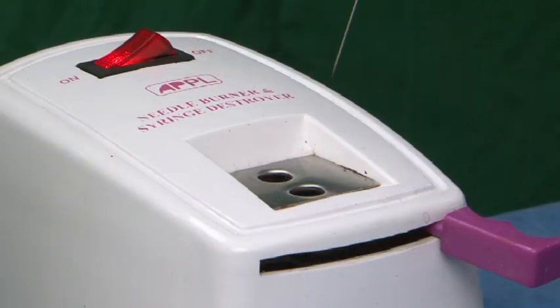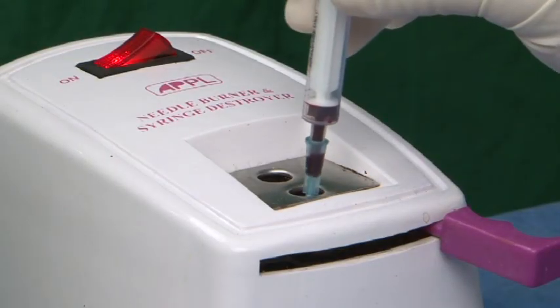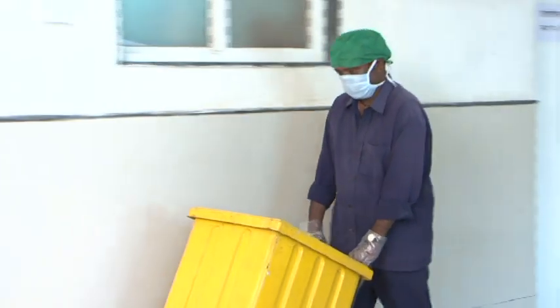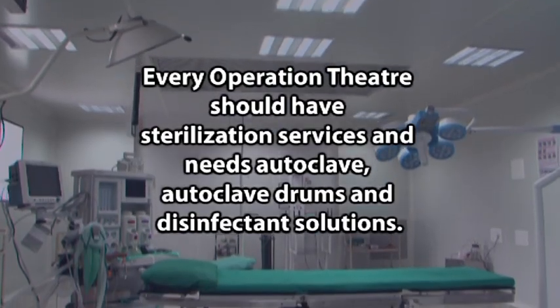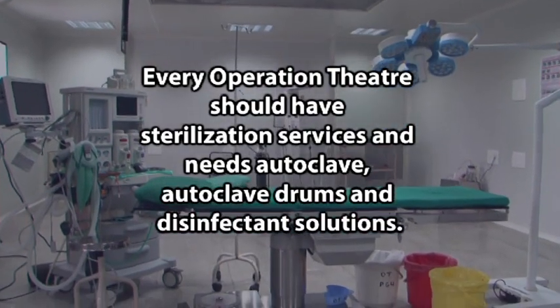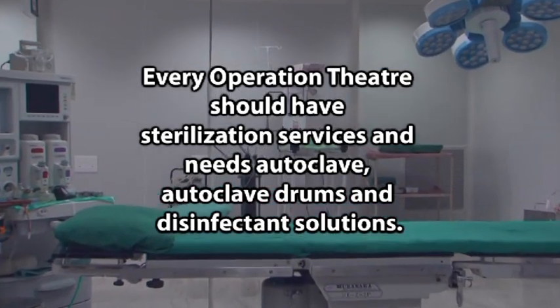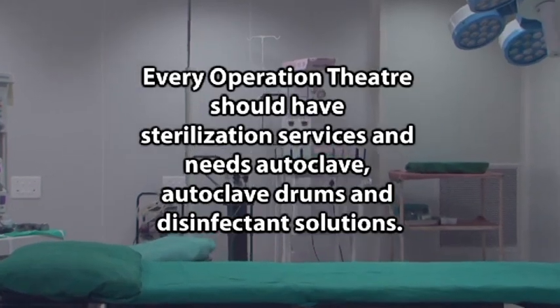There should be arrangements for disposal of biomedical and other wastes, which should be in accordance with the national and state regulations. Every operation theatre should have sterilization services and needs autoclave drums and disinfectant solutions.